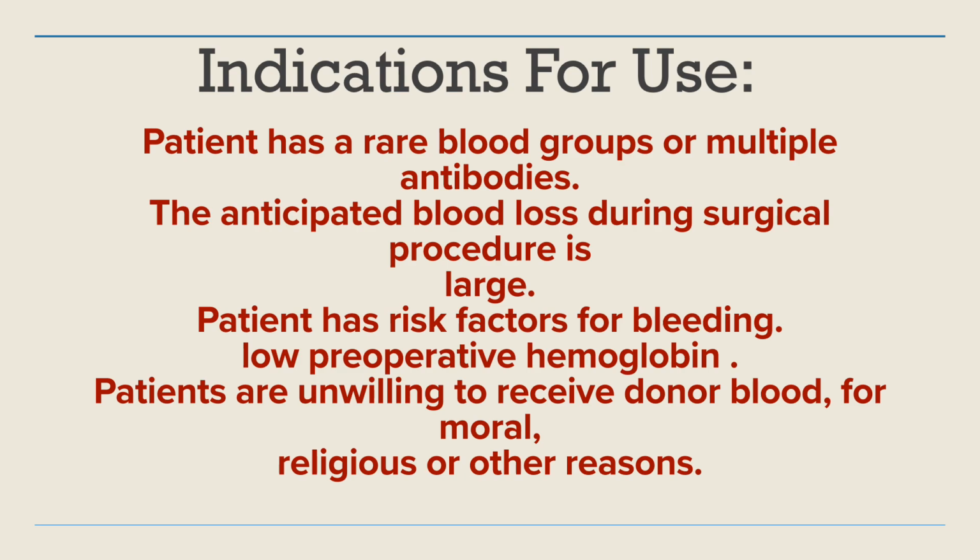Indications for use: the patient has a rare blood group or multiple antibodies. The anticipated blood loss during the surgical procedure is large. The patient has risk factors for bleeding. Low pre-operative hemoglobin. The patient is unwilling to receive donor blood for moral, religious, or other reasons.